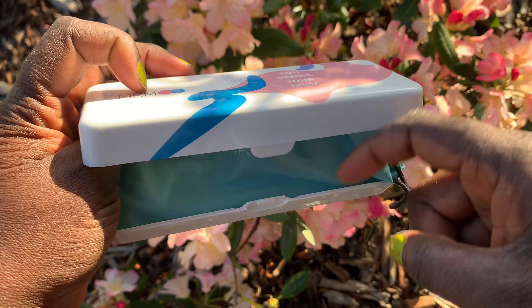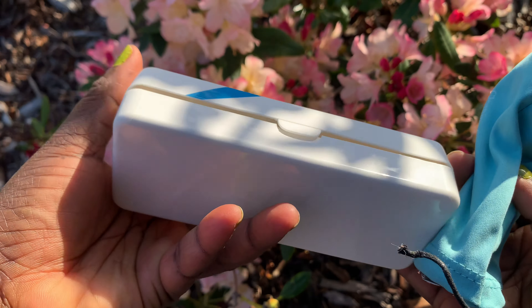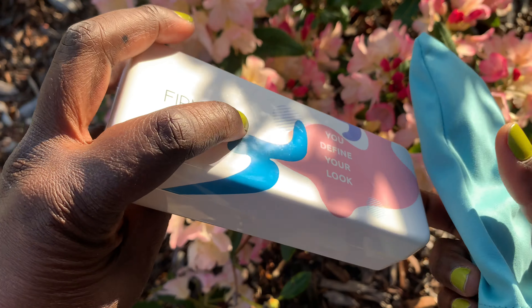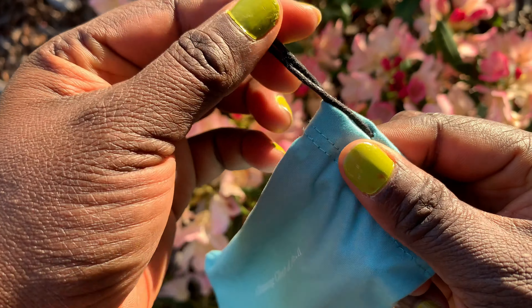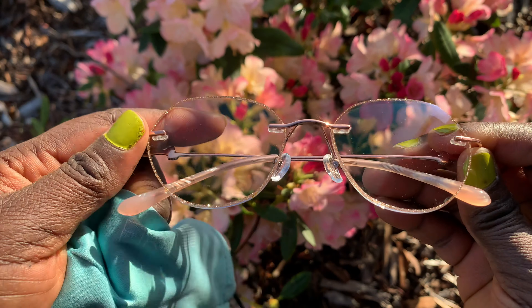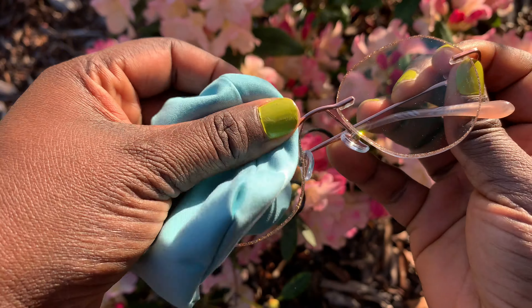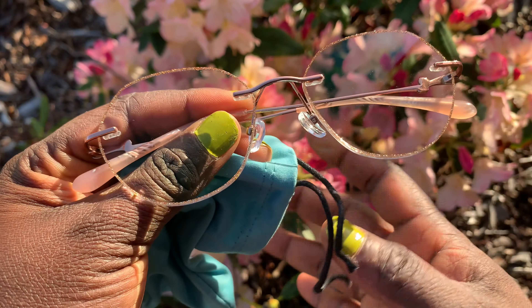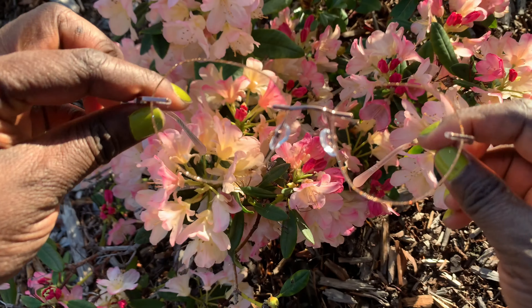It comes in a very sturdy casing so your glasses are well protected and won't break. It also has a pouch that acts as a cleaner and protects the glasses as well. As you can see from the earlier video where I tried on the glasses, it's sturdy, stylish, comfortable, and best of all, affordable — going for about $39.